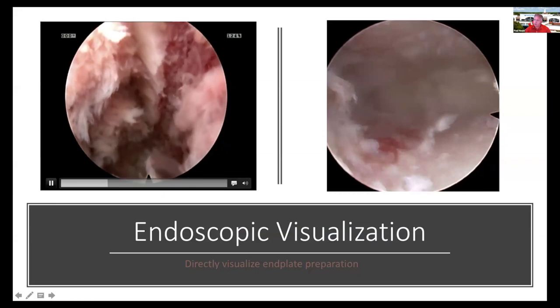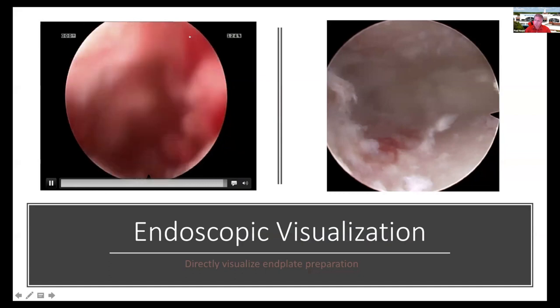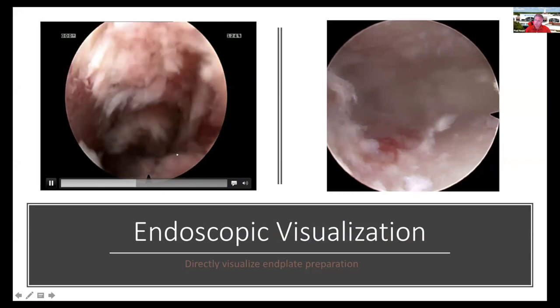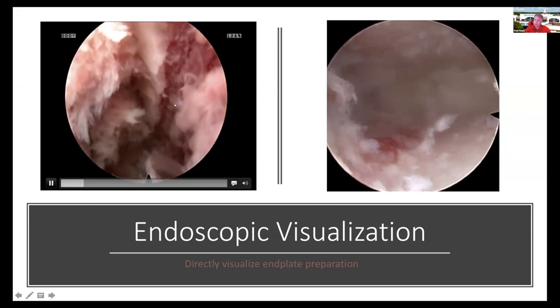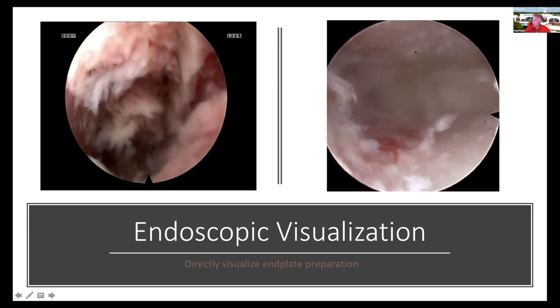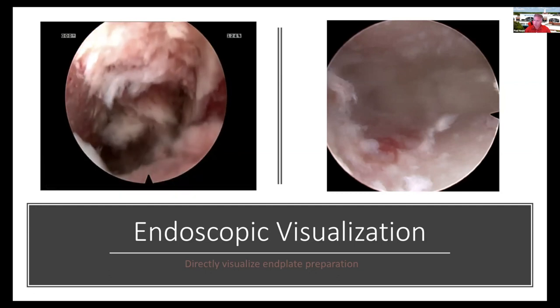One of the advantages of using the endoscope is that in the very early stages of disc material removal, you can actually see the interface between the cartilaginous endplate and the bony endplate. Obviously there's a tremendous amount of work to be done here, but you can see inside the disc space during preparation. Before you deploy a cage, you have the ability to go in and inspect the endplate, and you can actually see the amount of bony endplate removal you've achieved — it's nice to use your endoscope to inspect before deploying a cage.